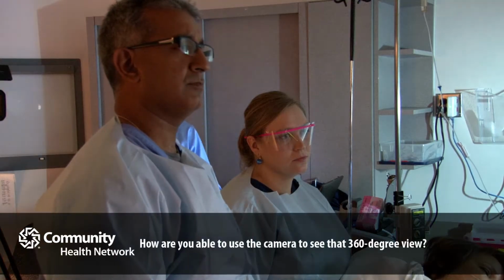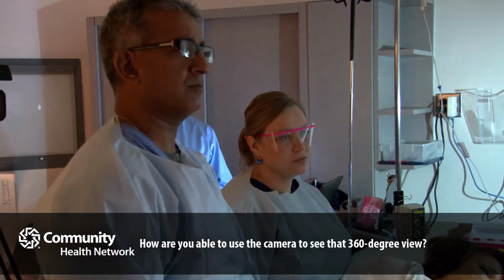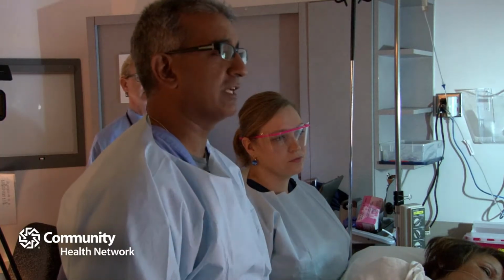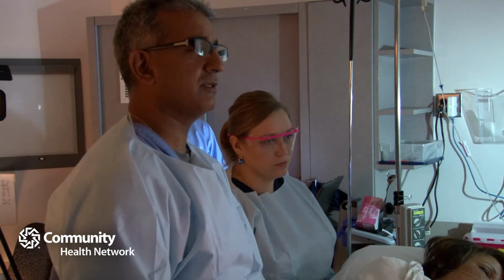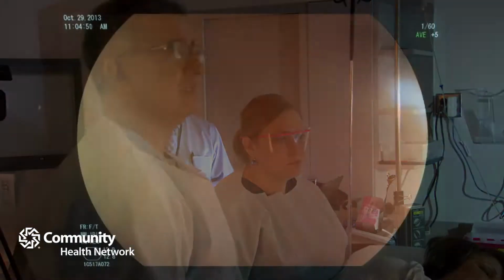Another tweeted question that we just got was, how are you able to use the camera to see that 360-degree view? Yeah, that's a superb question. It's actually a limitation. So really, I don't have 360. There are some cameras coming out that are getting to 310 and things like that, but my limitation is maybe 270 at the most.